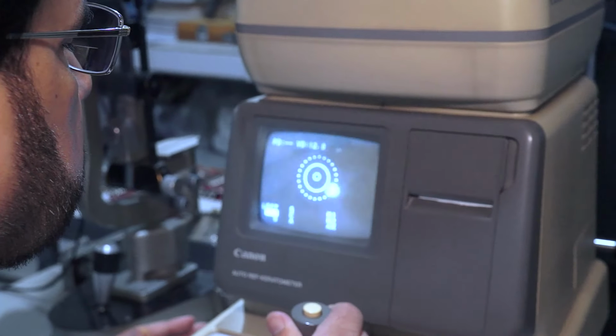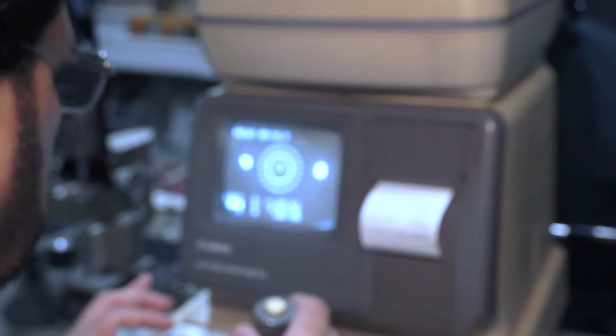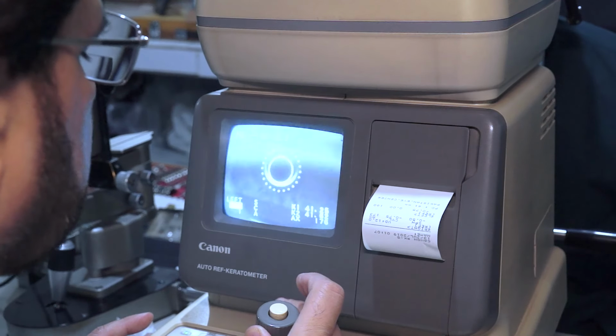Now we are going towards the left eye, and again you have to ask the patient to look at the target. Look at the red color hut. Now here it is finished, and automatically you can see the print of this one. This also has a mode called keratometry, which is the measurement of the corneal power.